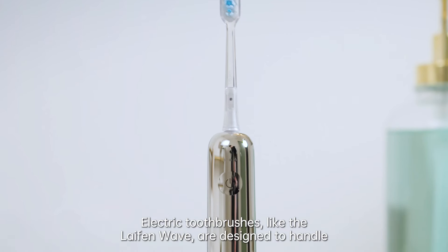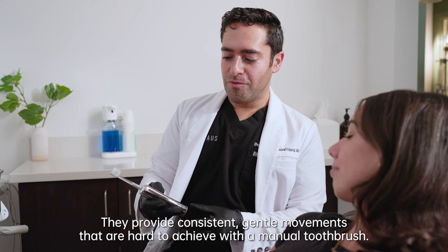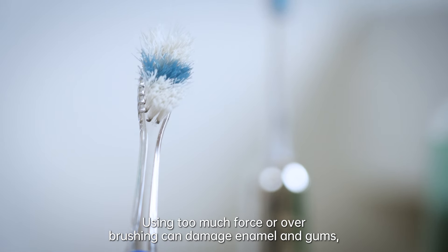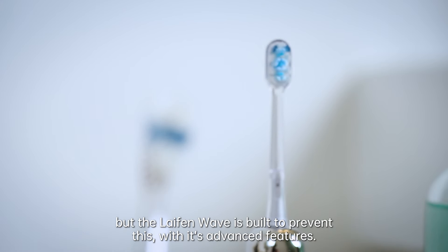Electric toothbrushes like the Laifen Wave are designed to handle most of the brushing work for you. They provide consistent gentle movements that are hard to achieve with a manual toothbrush. Using too much force or overbrushing can damage enamel and gums, but the Laifen Wave is built to prevent this with its advanced features.